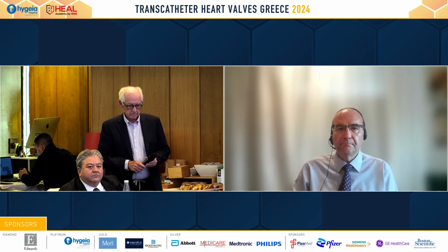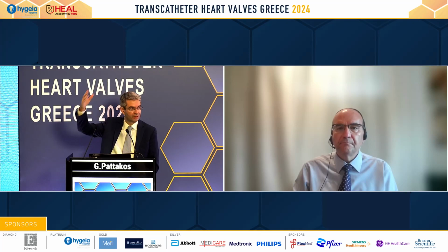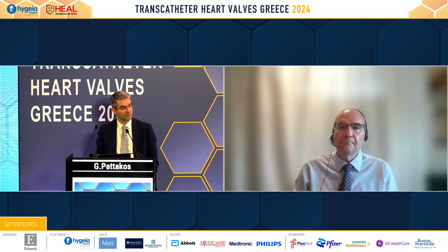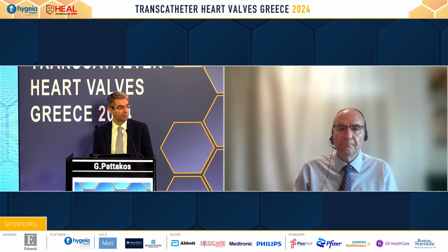Fantastic. Thank you very much, Dr. Mack, for your comments. And I think having Dr. Reardon, Dr. Mack, Dr. Kilitz, and all of our guests, local and international here, this is what this meeting is about. So, we're very excited to hear everybody's input. I think that part of the issue is, as I said, with planning, that you don't want to have a 19-millimeter valve in a patient and then tell them, yeah, we're going to do a TAVR down the road when this fails, because we know that's going to be exceedingly hard, or you're going to end up with huge valve gradients, which are things that we don't want. So obviously, in the country that invented the term of everything in moderation, we wholeheartedly agree with you. Pan metron ariston.